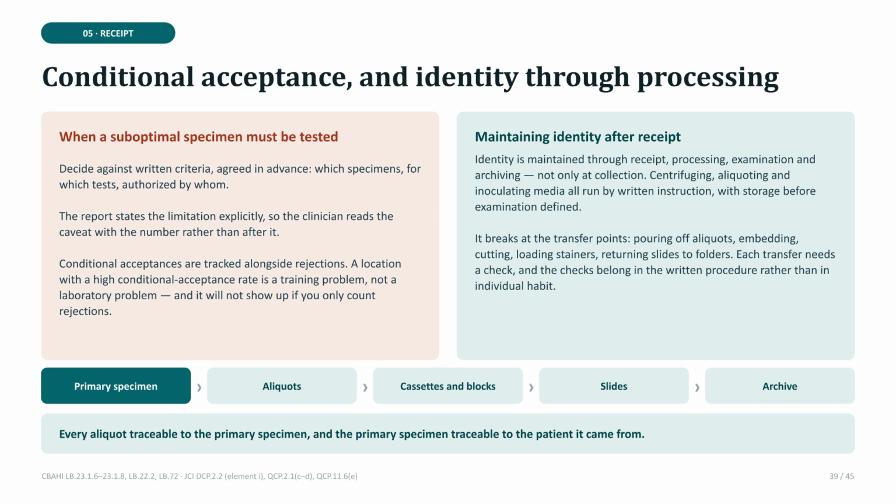Packaging must always include a leak-proof primary container within secondary containment labeled for biohazards. Remember that tracking systems are mandatory. If a specimen is untracked, it is effectively lost to the laboratory process.